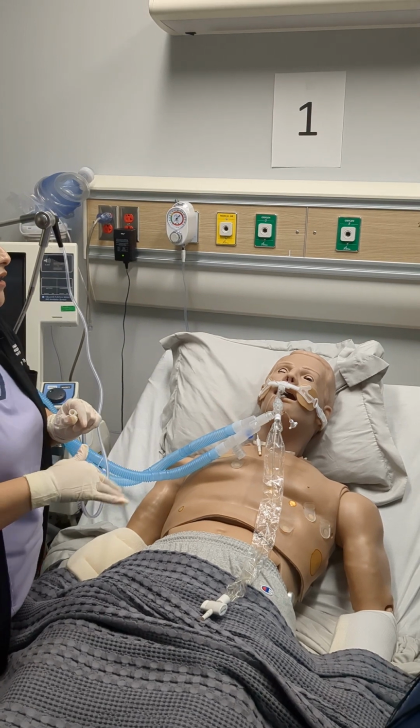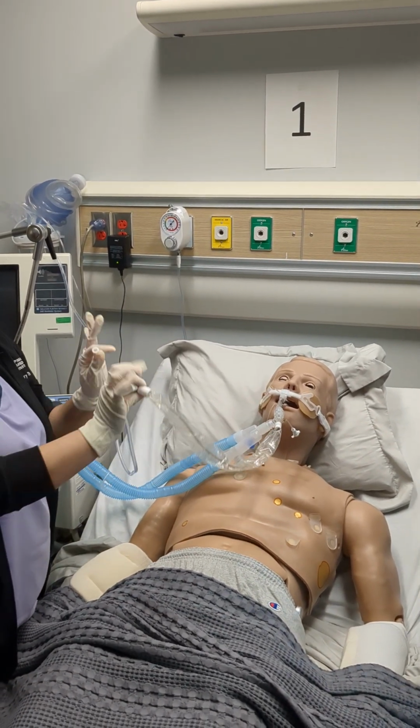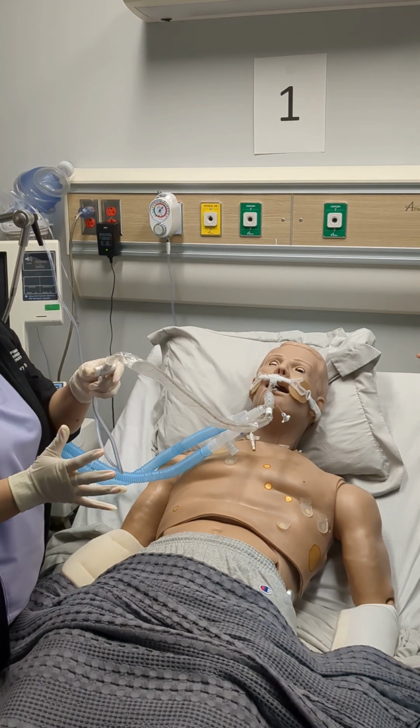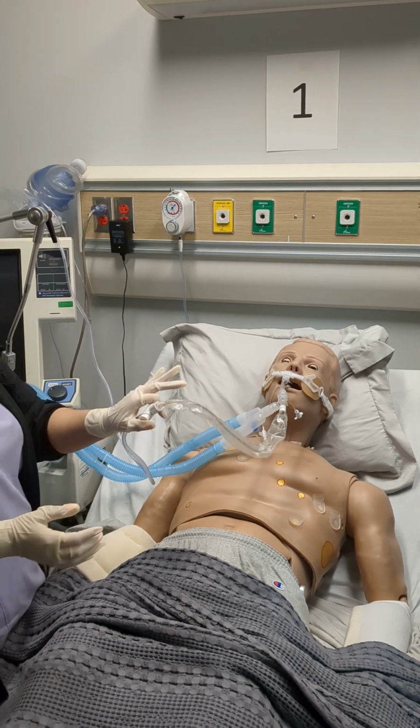Unless I need more, then I'll do more pressure. So what I'm going to do, I don't have to have a sterile field. These are just regular gloves, okay? I'm gonna connect it. I am going to unlock it. And that's okay because it's inline, right? It's inline, already sterile, okay? And this is how I grab mine, okay?